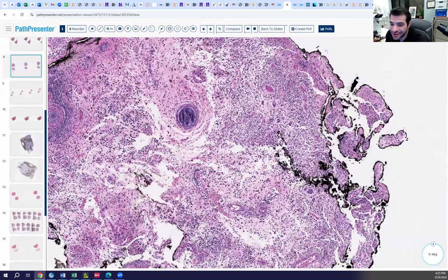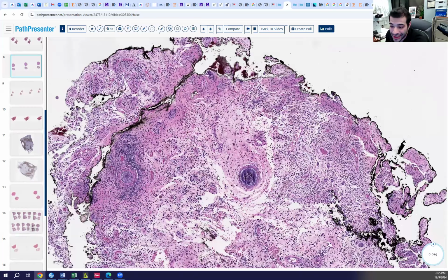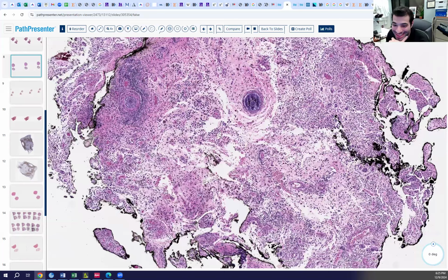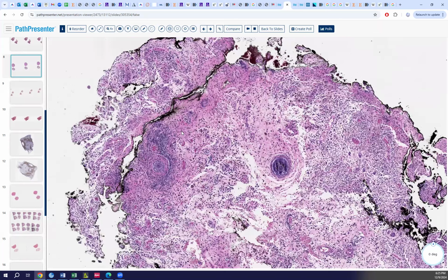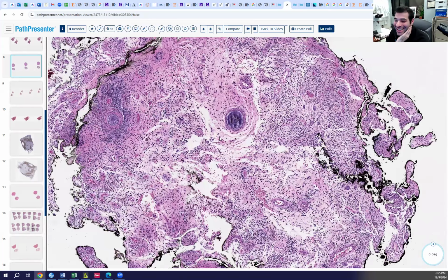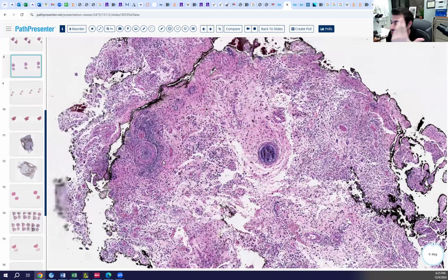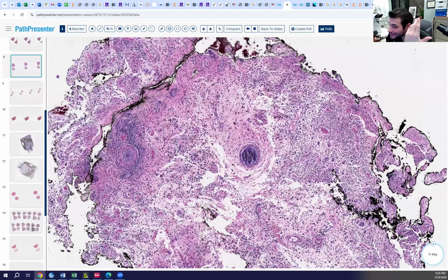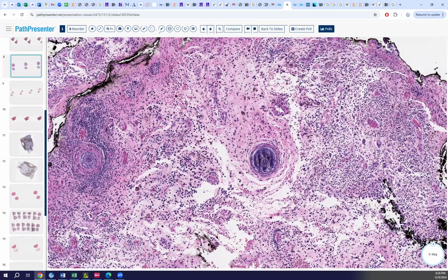Sometimes you can start getting sinus tract formations here. Well, we already said an example. This is HS. Or with HS you can get dissecting cellulitis of the scalp, the dissecting folliculitis. Dissecting cellulitis of the scalp, yeah. And by the way, when you mention HS, it's related in some way. What way is it related? It's part of the follicular occlusion triad. Yes, it's part of the follicular occlusion tetrad. And what is the follicular occlusion tetrad?